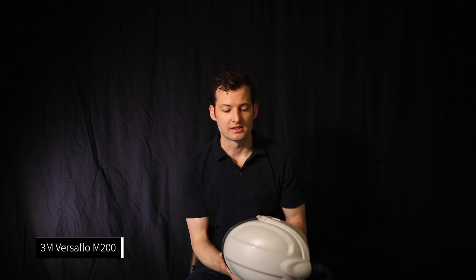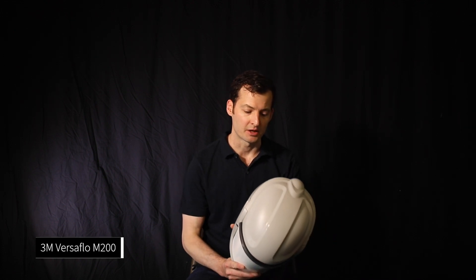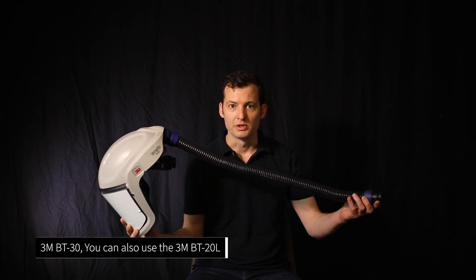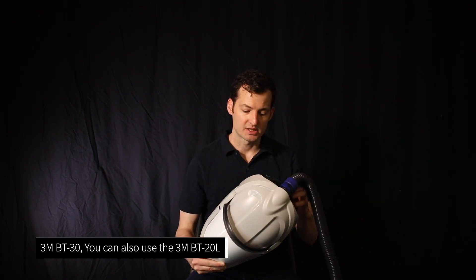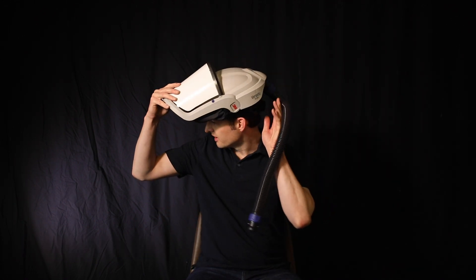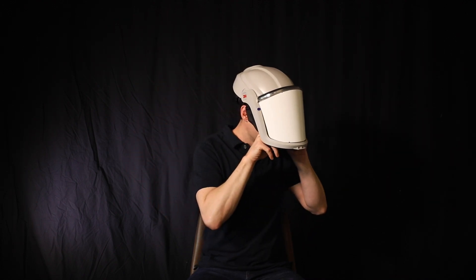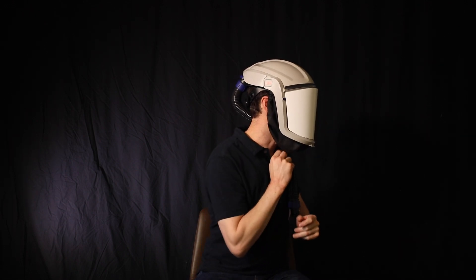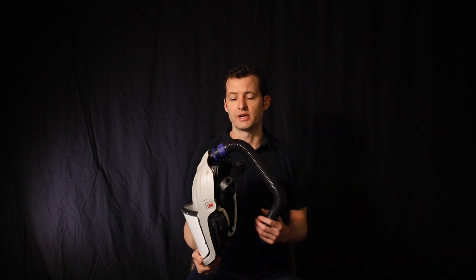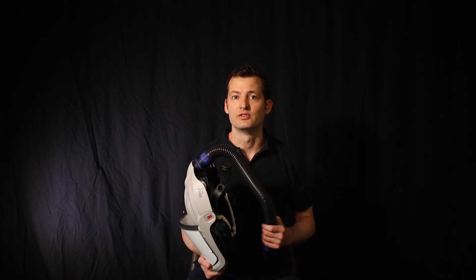Typically those things look like this. This is the Versaflow M200 — a PAPR helmet. This is the Versaflow BT30 hose that would normally hook up into your PAPR. This is similar to a welding helmet. You put this on; it has an adjustable ring in the back to tighten or loosen it. This is pulled over the face and then you pull this over to provide a seal around the face and helmet. I'm going to show you how to run this continuously without batteries, without filters, off of your medical air supply.